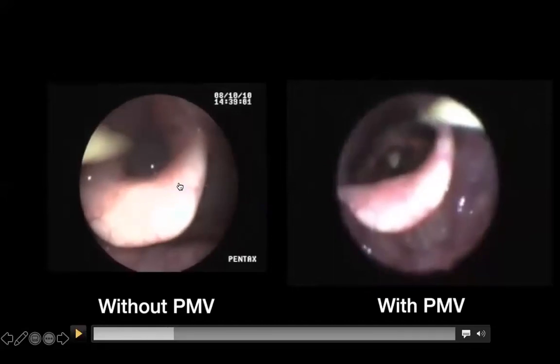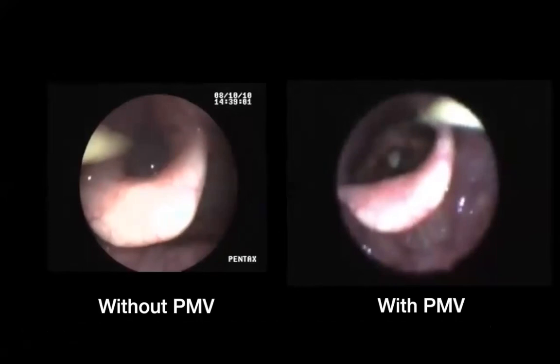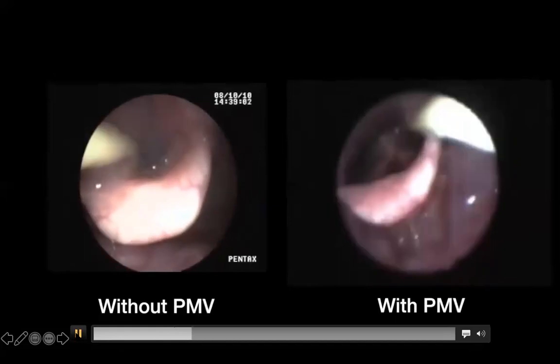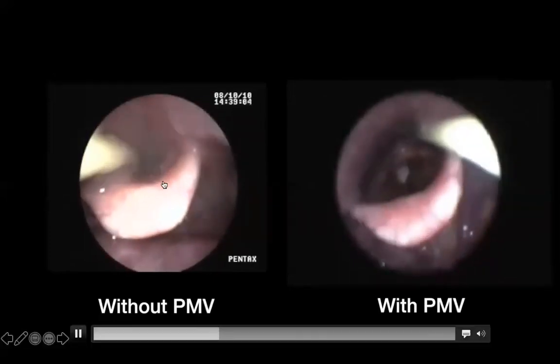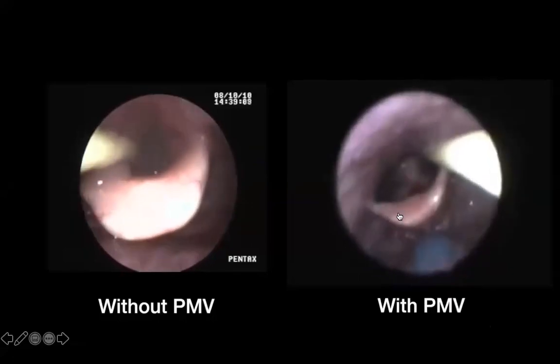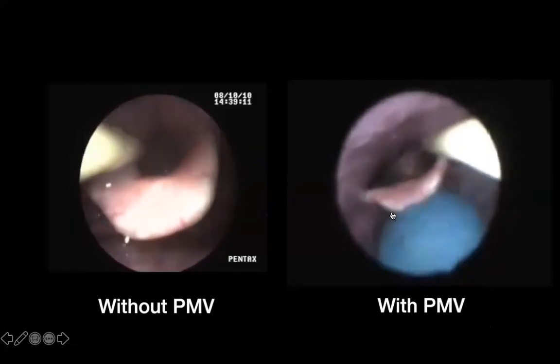You can see that he's trying to adduct his false vocal folds and vocal folds. It's creating bubbles, but he's unable to initiate the swallow. Whereas in here, he's able to initiate a swallow. It's not a perfect swallow, but he's able to swallow safely.